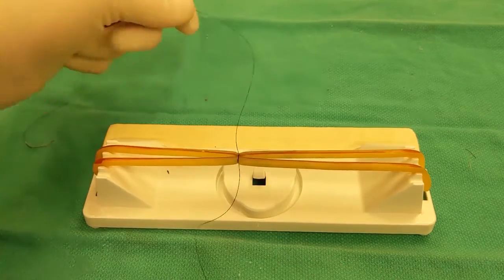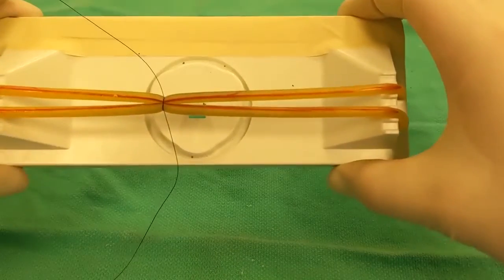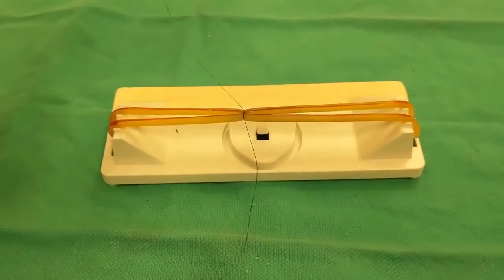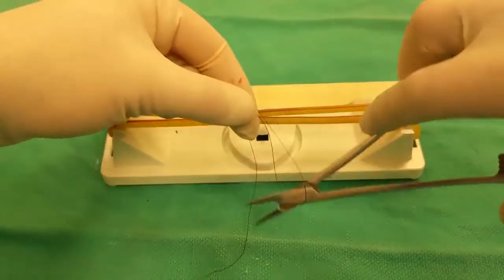And you can see here, it's maintained tension much better than before. Only the first throw is a double wrap, and all subsequent throws are single wraps.